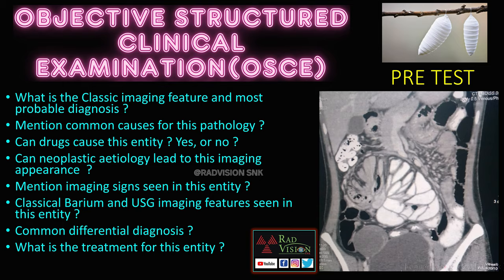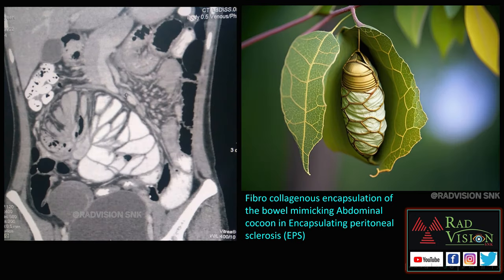This is the image you can see — you can pause the slide. This is the pre-test; you can answer all these questions after listening to this lecture in the post-test. You can see there are multiple small bowel loops, typically clumped or clustered in the central abdomen, surrounded by a hypodense membrane, giving a cocoon appearance. This is nothing but fibrocollagenous encapsulation of the bowel, mimicking the abdominal cocoon in encapsulating peritoneal sclerosis (EPS).